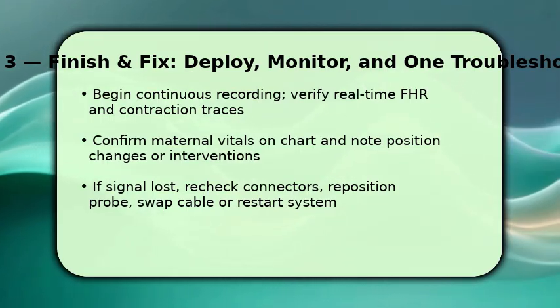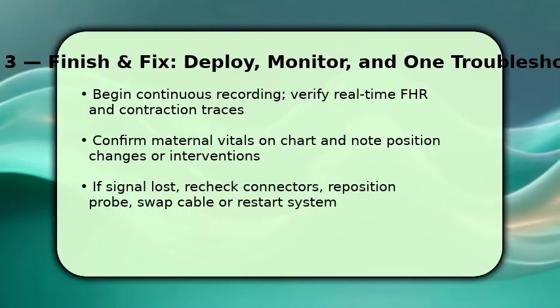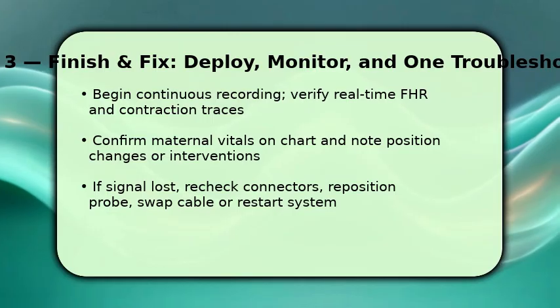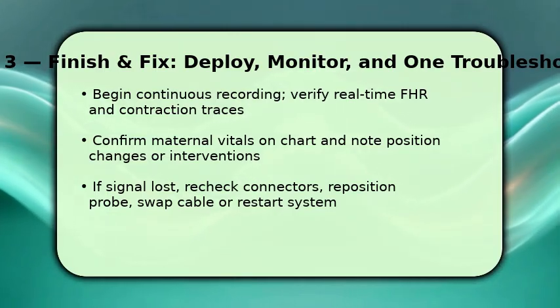If you lose signal, first check connectors and belt tension. If that fails, reposition probes, swap cables, or restart the unit. These steps resolve most issues quickly.